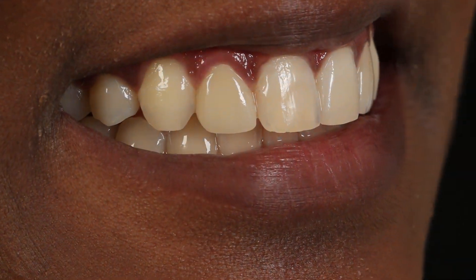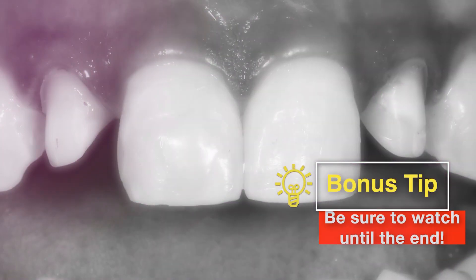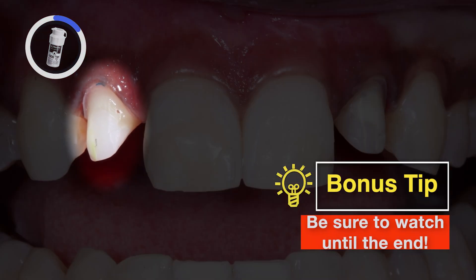Well, that concludes the treatment process for this case. The patient was very happy with the new restorations, even commenting that the results exceeded her expectations. I'll take you through the final delivery of the Bruxer aesthetic crowns on tooth numbers 7 and 10.